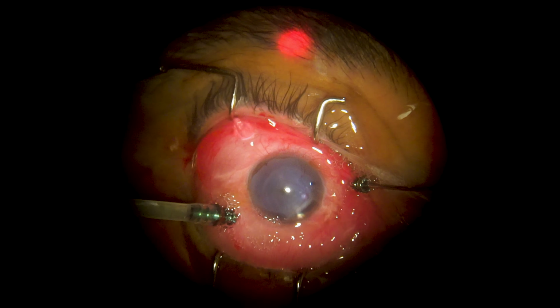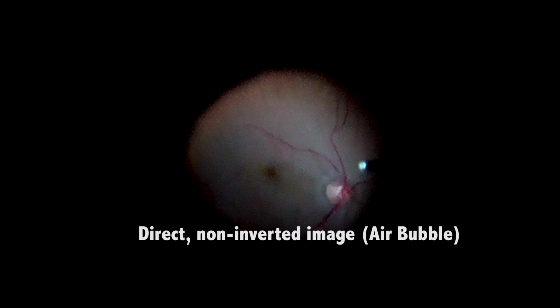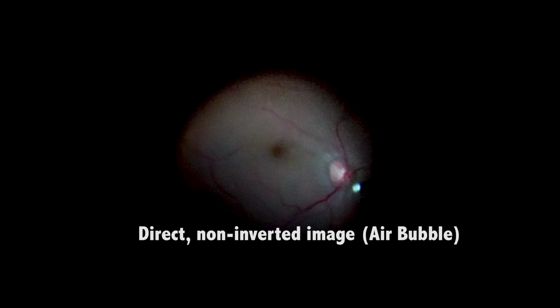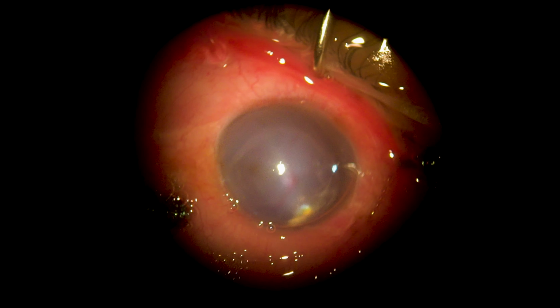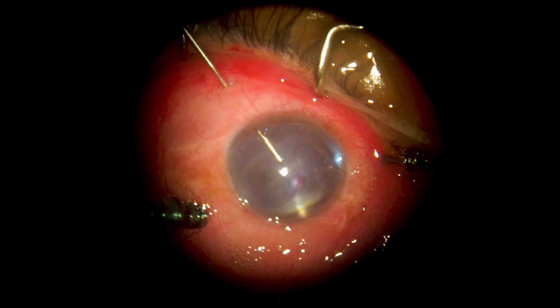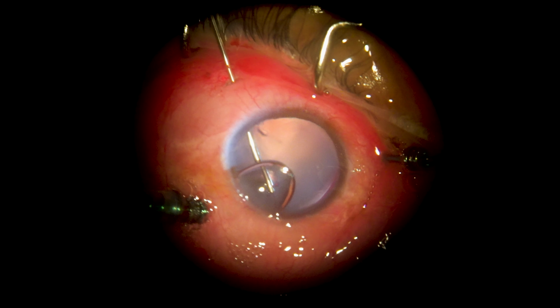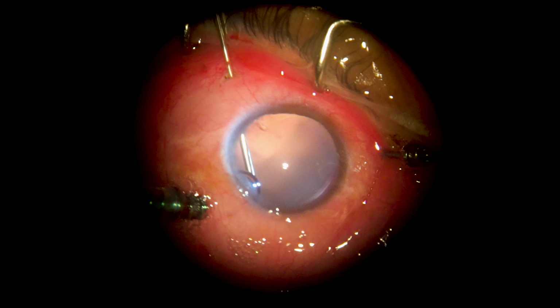An air bubble was injected in the anterior chamber to create a lens effect so that we could observe the retinal periphery better. You see that the image is direct and not inverted because of the air bubble. So we removed the air bubble. With the contact lens now, the area was ready for the maneuver.